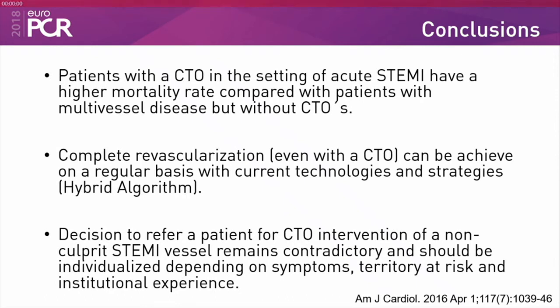Of course, if the result is good and the patient is fine, it means that you have done a good job. But each time you have to balance what could be the potential benefit for my patient. It is a discussion in terms of quality of life and in terms of longevity. What could be the potential benefit in this patient? What could be harmful is what somebody underlined 2 or 3 days later about the kidney, and then crossing with a wire. Maybe it can be harmful, and then it's a self-critical decision making about what could be the potential benefit for the patient.